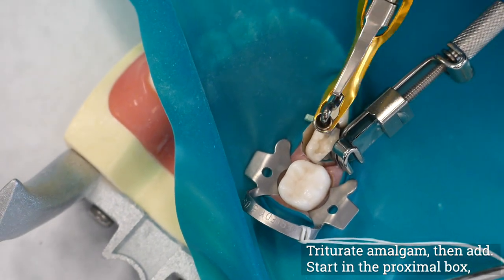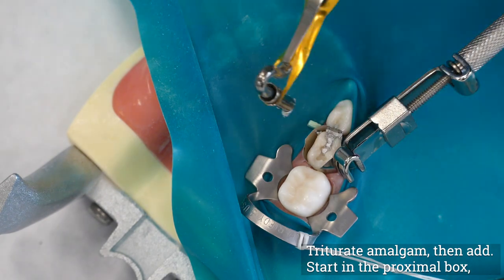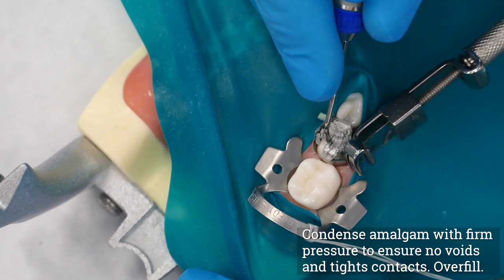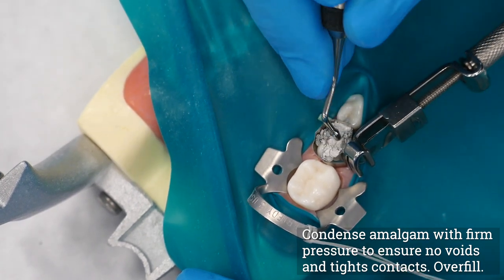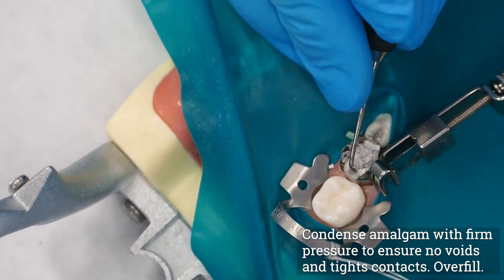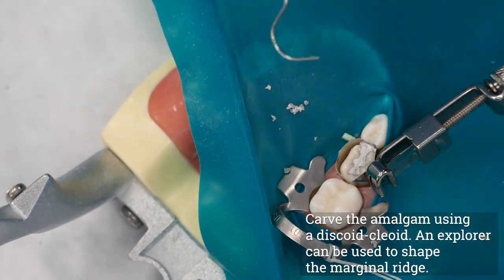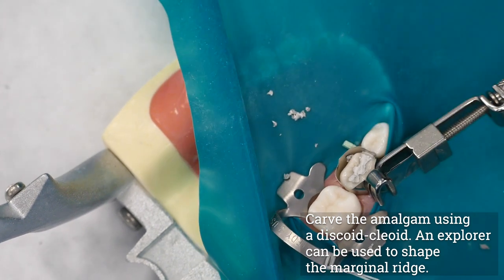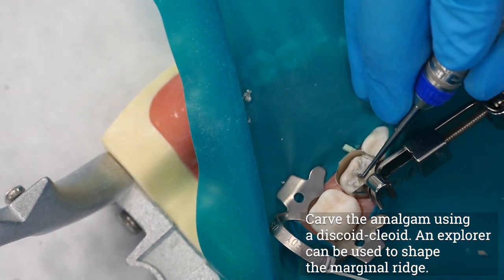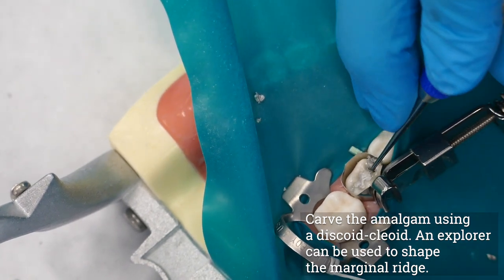Triturate the amalgam and, using the carrier, add the amalgam to the preparation in single increments beginning in the proximal box. Using a small condenser, condense the amalgam into the corners of the proximal box and against the Toffelmeyer band to ensure the re-establishment of a tight proximal contact. Continue filling and condensing until the entire cavity is overfilled. Use a small round burnisher to begin the initial contouring of the amalgam. Carving the occlusal portion is performed with a small cleoid-discoid carver, as in class 1 restorations; the marginal ridge can be carved with the tip of the explorer or with a Hollenbeck carver.